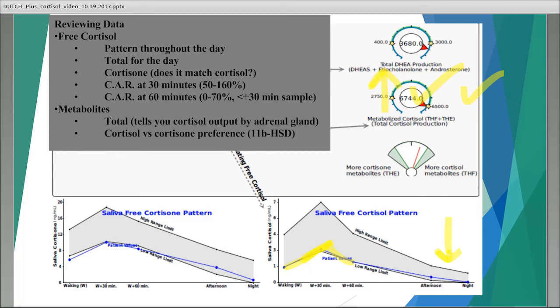Lastly, we can look at, does the cortisol hang out in its active form, cortisol, or its inactive form, cortisone, predominantly? In a case like this, you can see it's favoring slightly cortisol. What that is, is just looking at the total of the cortisol metabolites and the total of the cortisone metabolites, because that's the best way to assess whether cortisol is in its active form or not. And whether that's good or bad may depend on the overall picture. If you have someone with relatively low levels of cortisol, then favoring cortisol over cortisone may actually help you because you're keeping it in its active form.